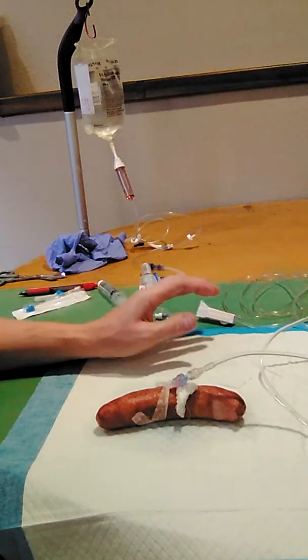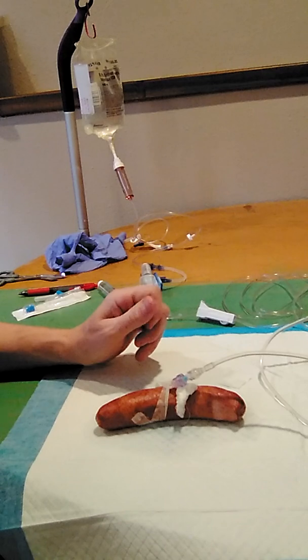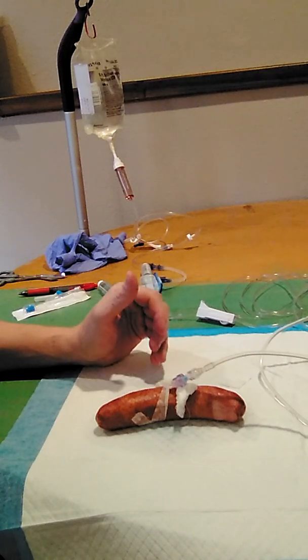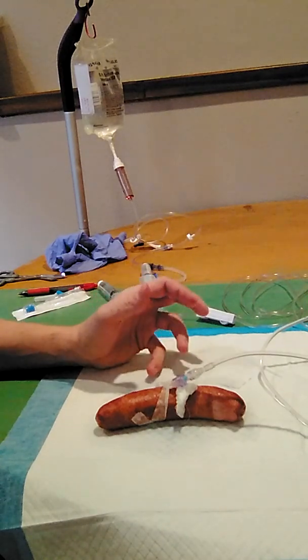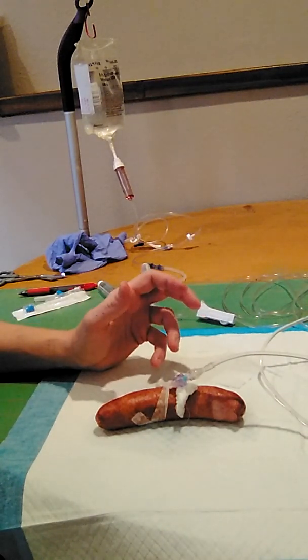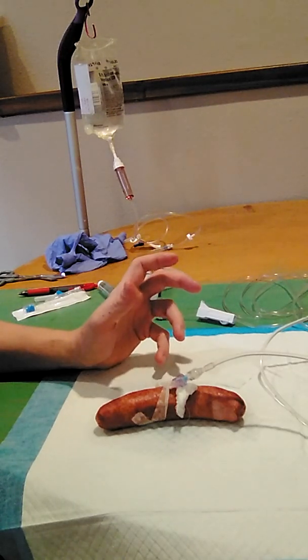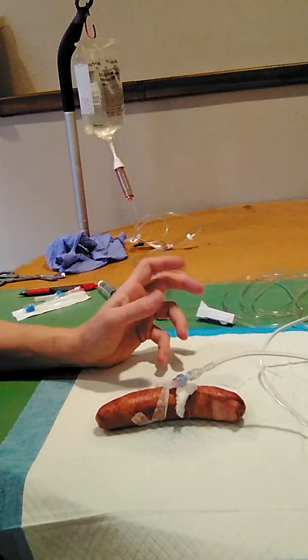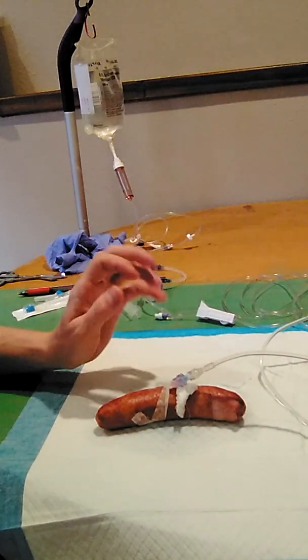Now I'm going to explain to the patient how to maintain the lock here, and do some patient teaching. And I'm going to document all the relevant information on the MAR, being who I am, what time I did these things, what I did, and that would conclude the first series of this assignment, being the continuous IV to the lock, which was occurring initially and now it is locked.